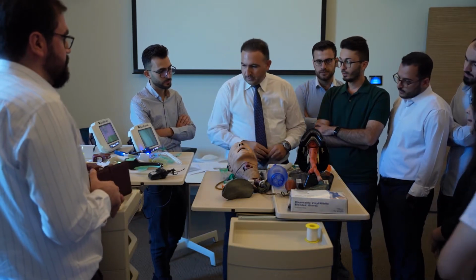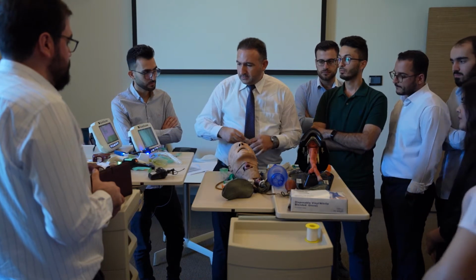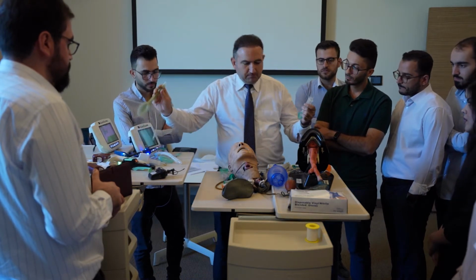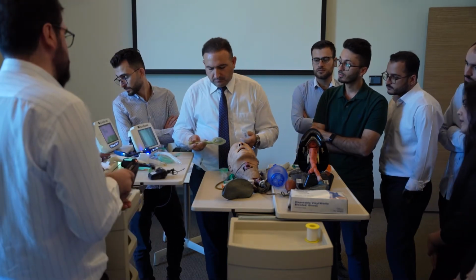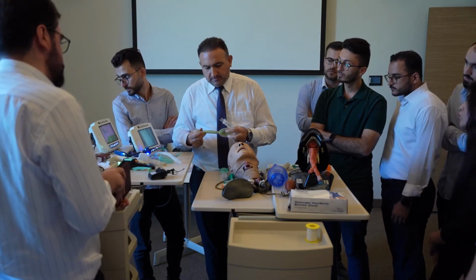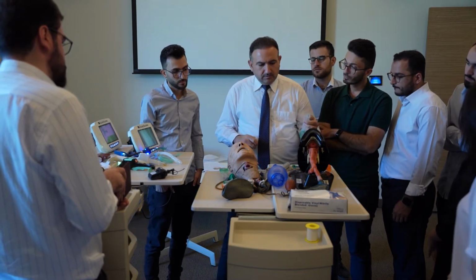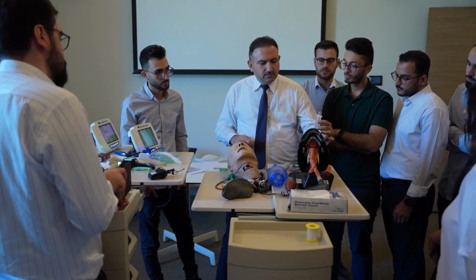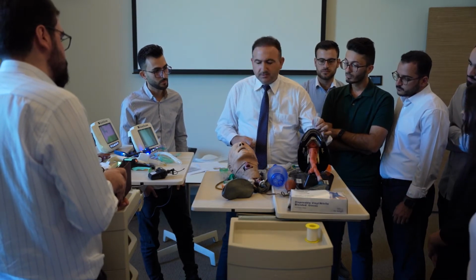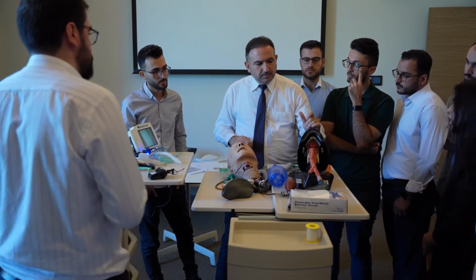Doctor, the procedure for the iGel, please. It's a blind technique. The only difference between the laryngeal mask airway and the iGel is that one is inflatable and this is not. So there is already, let's say, bulging, while the laryngeal mask airway has a balloon that should be inflated. Simply, it's just to ventilate. You will not see it too much in an emergency. There is a side orifice for suction, and at the distal end there is a tip.